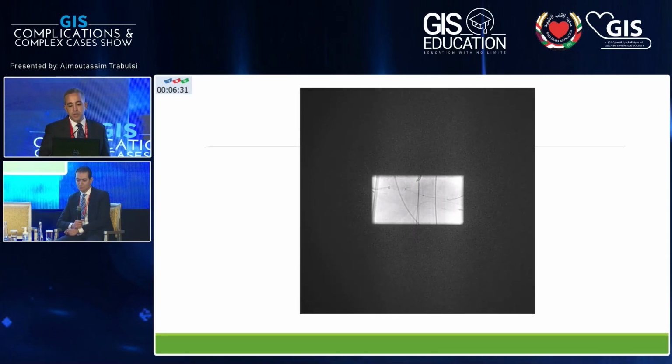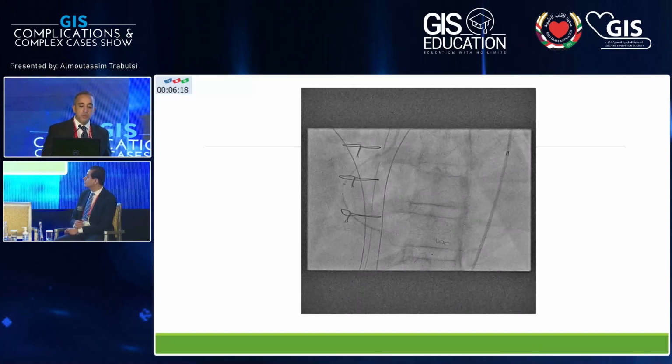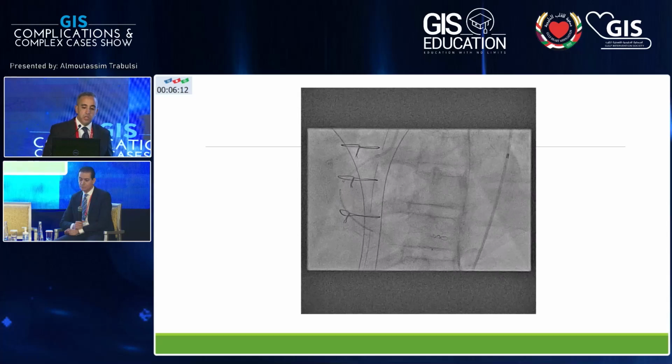And then you can see here is my Telescope and trying to push my equipment, my stents, ballooning. I put a 2.75 stent there, post-dilated with a 2.75 to high pressure. And then again, same thing, I couldn't pass any stents, and I had to use my Telescope to try to get my 4.0 by 38 stent into the distal mid-segment. Deployed the first stent.